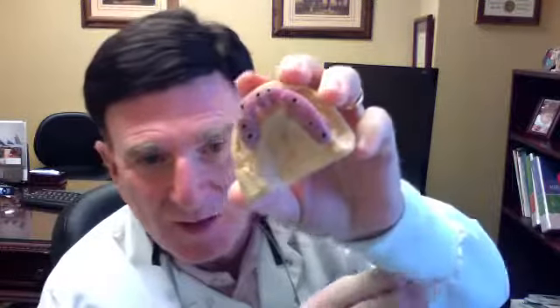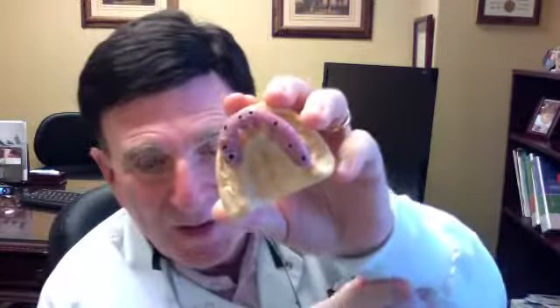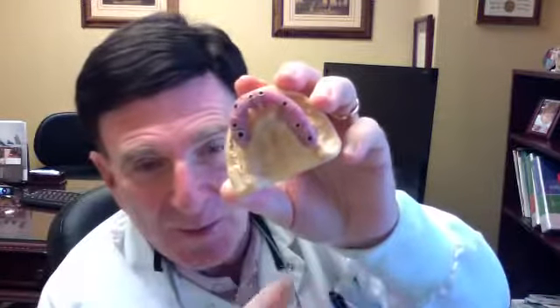Well, this is what a verification index looks like. I'm going to hold it up here if I can. What I basically did is I had my technicians place temporary abutments. You can see the little metal rings there. Screw them into each implant. Then around each of those temporary abutments, we put temporary cylinders and resin, acrylic, plastic. And they're all individual, so you can see the slices in between. What we then do in the mouth is we screw these in and take x-rays to make sure they're fully seated, so we know each of these pieces is screwed to the top of the implant accurately.